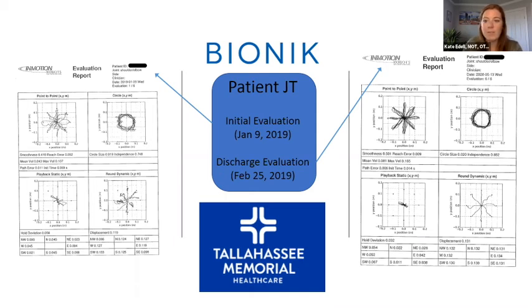Okay. Obviously we use it a lot on stroke, spinal cord, Parkinson's disease, even MS. Really, I've used it with probably every neurological diagnosis. Also, like I said earlier, I do an assessment called Drive Able, which is a cognitive assessment for driving.